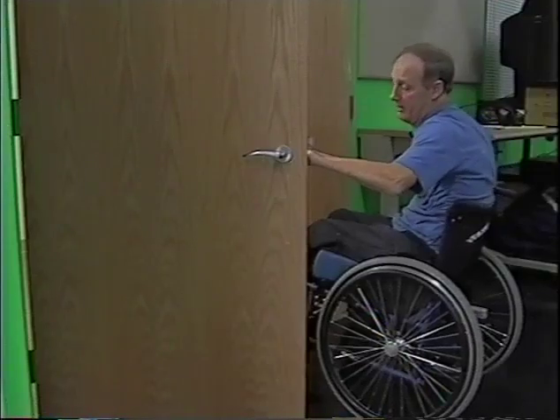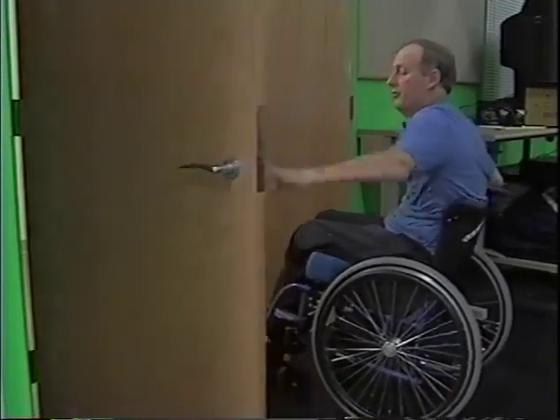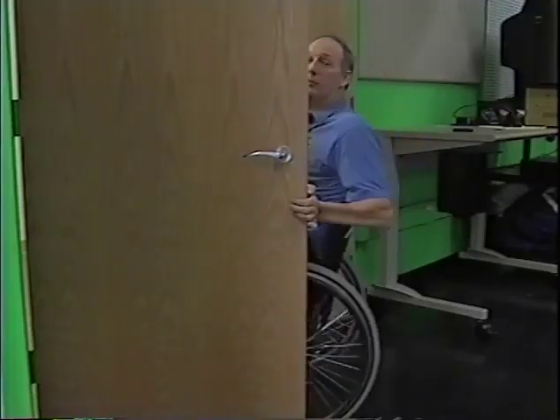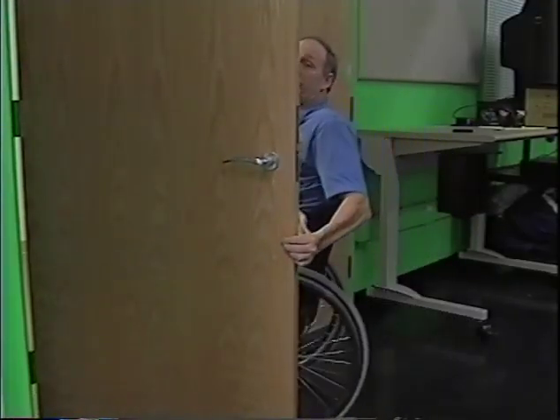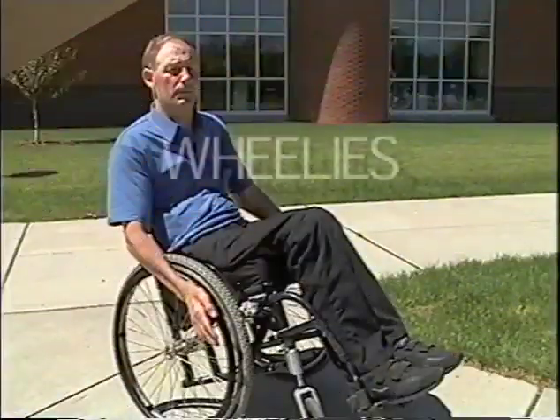And here, if you're a paraplegic, you have two choices. One, you can throw the door away and roll through, or you can hold on to the door and pull yourself through. And that's the standard way for opening doors for a paraplegic.